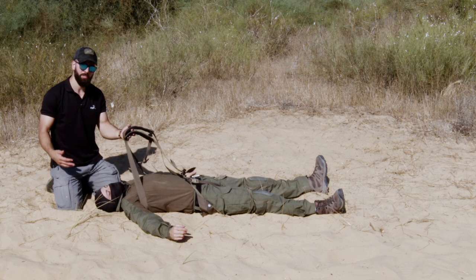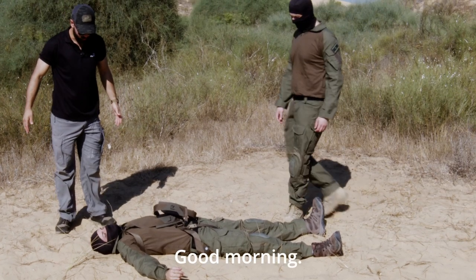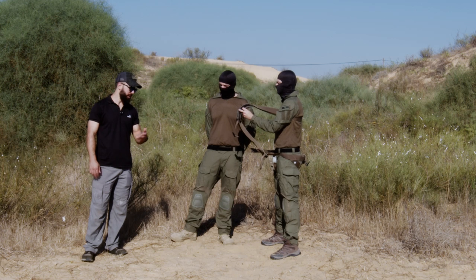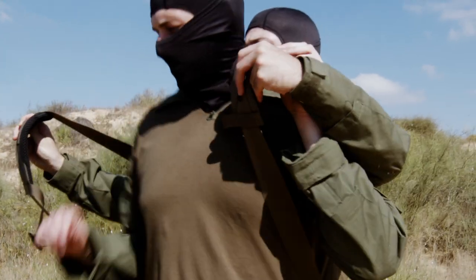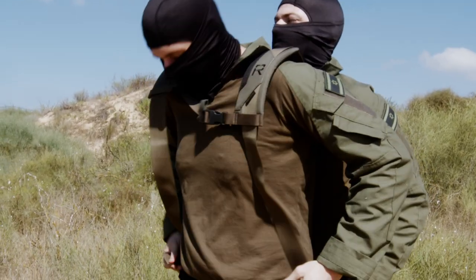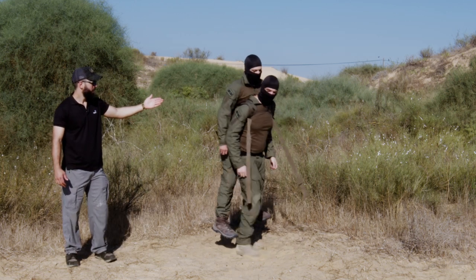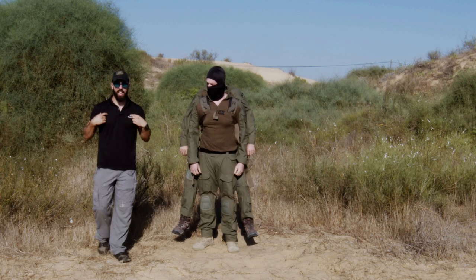Demonstrating how to lift someone from the standing position. Once the person is wearing the buddy strap, person A can simply put on the straps like a backpack and close the sternum strap. I don't recommend tightening all the way in the beginning — just a little bit. Put the straps on the shoulders and start taking up slack. Move down into a natural squat position, tighten up the slack as you go, then stand up and the person is on your back. Once the person is up, adjust these straps and this strap to get it in the right spot and ease the burden as you're walking.